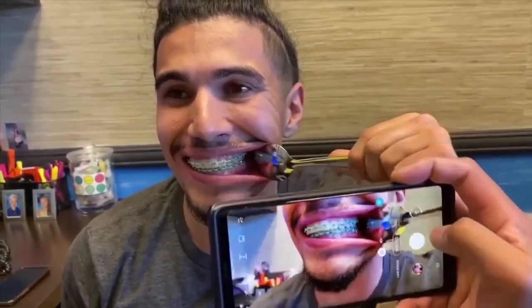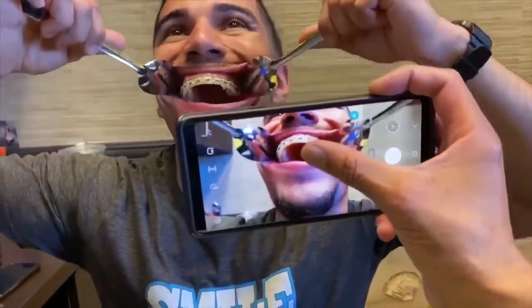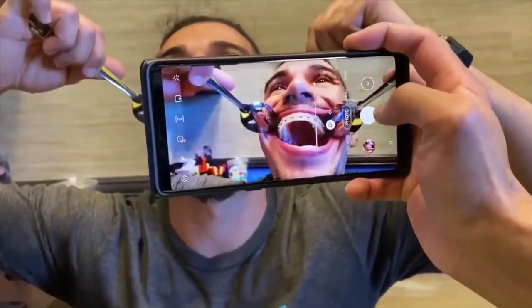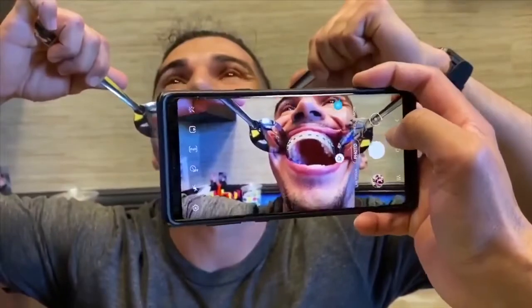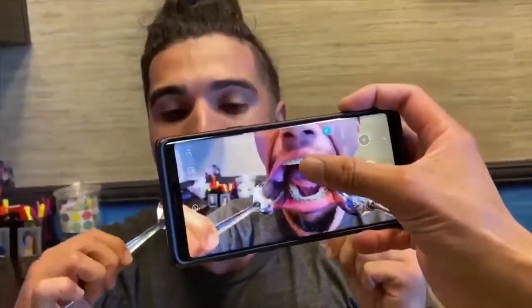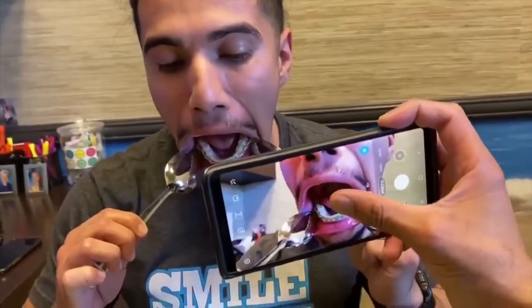The next one is gonna be called tooth four. We're gonna take the biting surface of your top jaw: you basically open as big as you can with the spoons separating the lips from the teeth. Then you do the same thing at the very bottom for the bottom biting surface, and you look down for this picture.